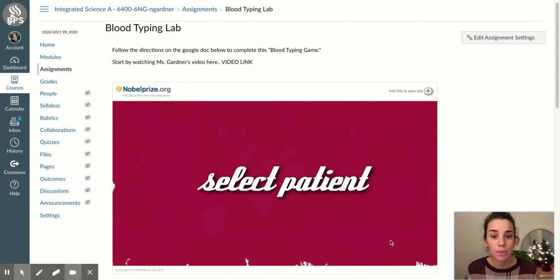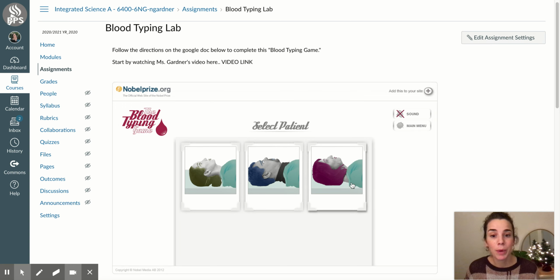You're going to proceed, and there are 3 patients. Here they are. You are going to do all 3. And your 3 may look different than the ones I have here. They're randomized. I'm just going to do one with you as an example. So let's pick this first one.